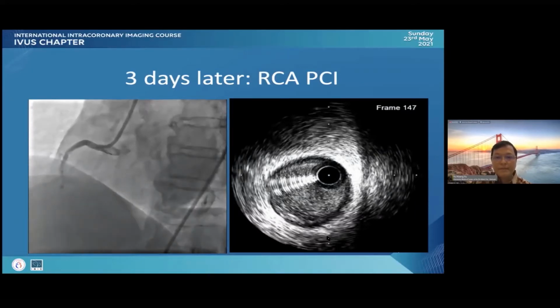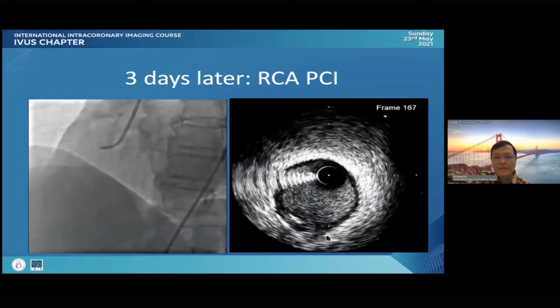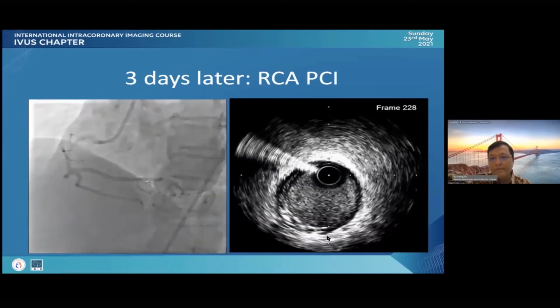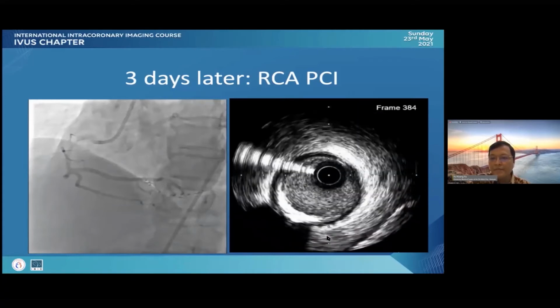All right. Before we move on, Dr. Vu, let me ask Dr. Amir now. Amir, what do you think if you deal with this situation? What is your strategy after seeing the calcified nodule in the proximal RCA?